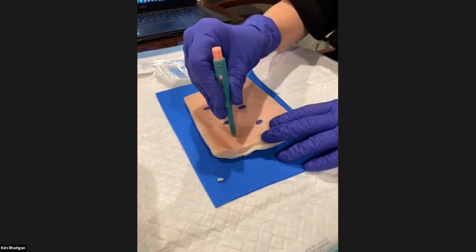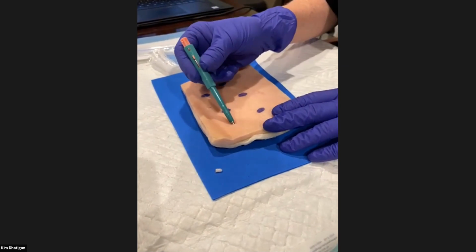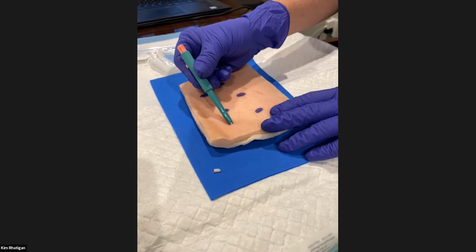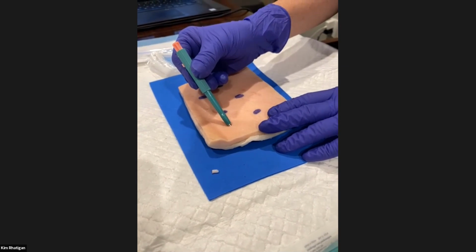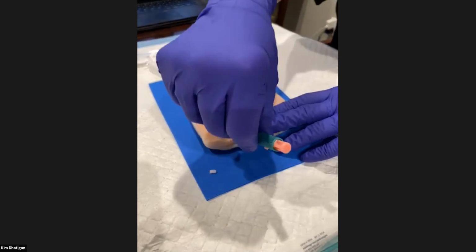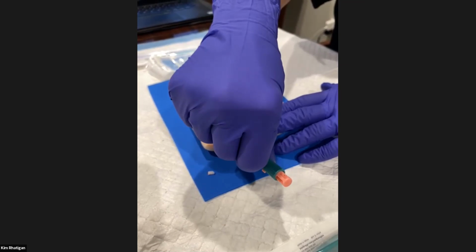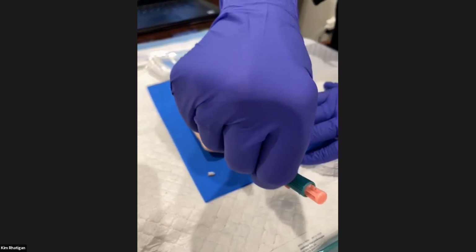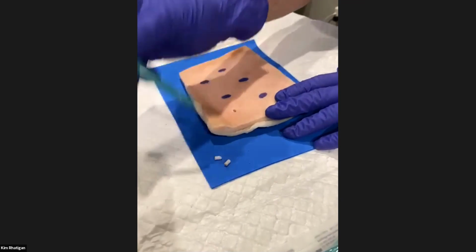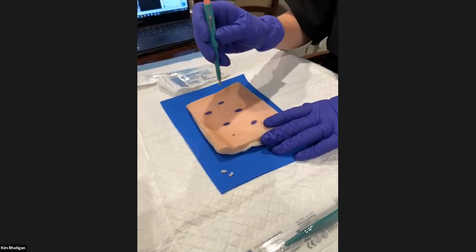I rotate, rotate, rotate. And this is thick skin, so don't be shy because this is thick, old skin. You're almost 70 degrees. Okay, a little higher, Dr. McClain. Do you want to guide me? Come back and cut it off. I recommend twisting to cut it, and then I'm going to pull it out gently. Pull it straight up. Well, I find if I pull it out sideways, they come out nicer. Sometimes they get stuck. I know, but you're doing a lot of damage to the skin. And the human. That pig's not going to bleed.